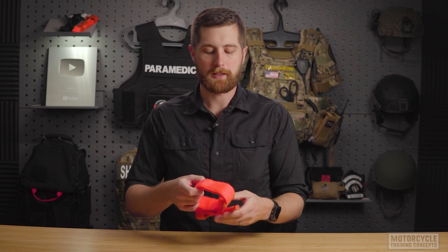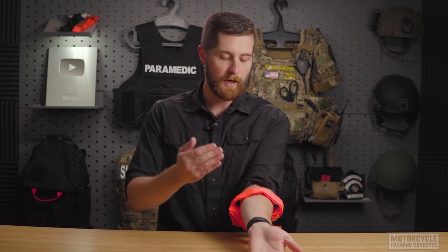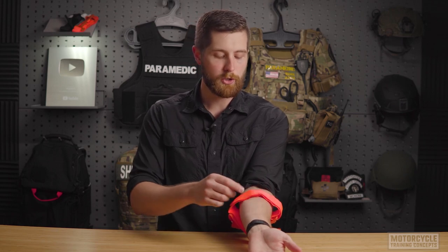When doing self-application with the CAT-style tourniquet, I'm going to take this and feed my arm into it. Generally speaking, if I can see where the wound is, I should place the tourniquet two to three inches above it, trying to avoid joint capsules, because that will result in injury to the patient and more severe pain than the tourniquet will already cause.